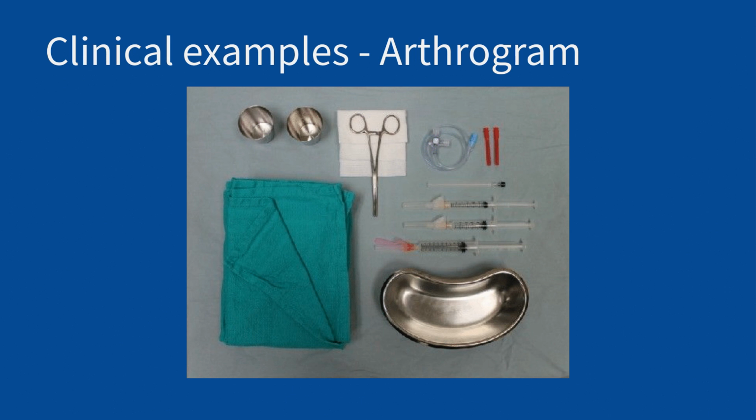And if you have any questions about whether or not your patient is able to get an MRI, either the MRI technologist or the radiologist can look up the different devices and how they interact with magnetism. So just give them a call, but you do have to know what kind of device it is that your patient has.